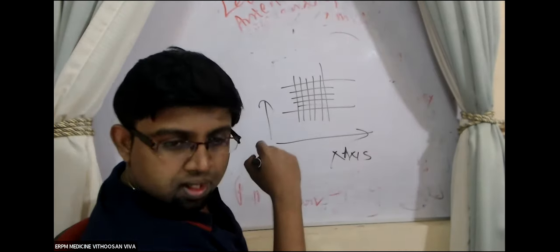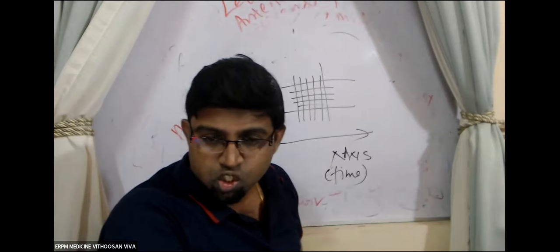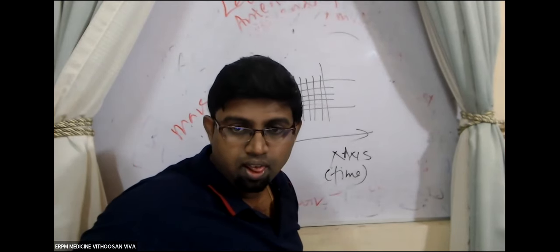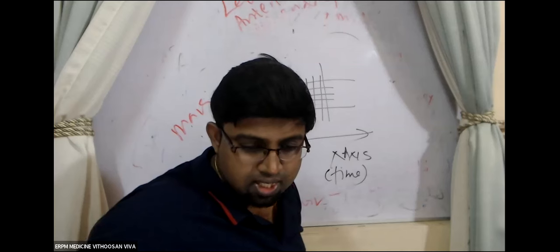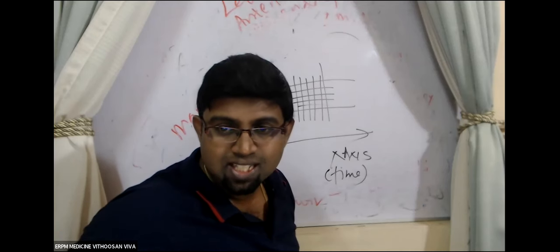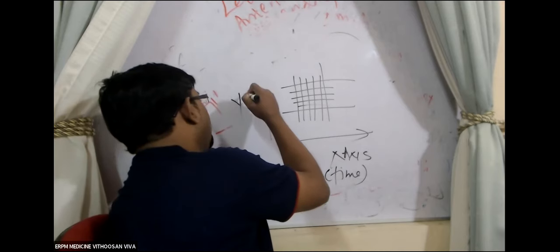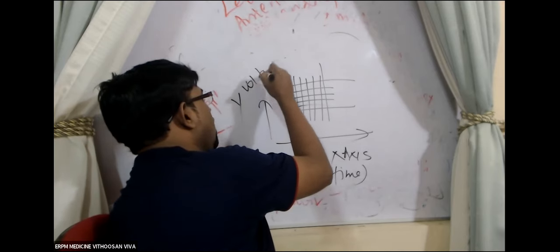What is running in the x-axis? In the x-axis, you are running the time.